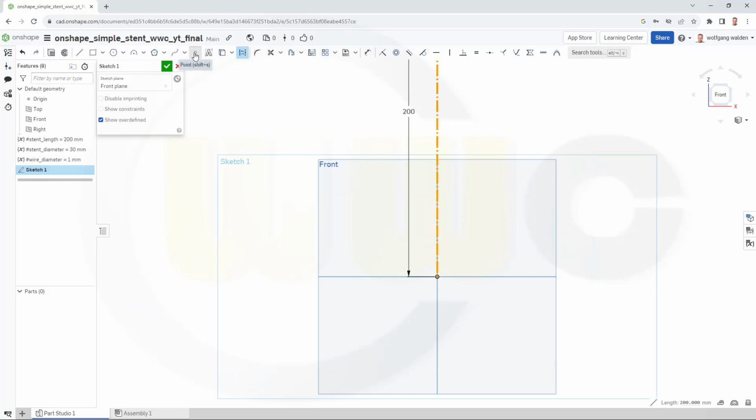Then I will need a point, and I put that point right there. And the distance here should be, I need it for my spline. So let's add a dimension. And this should be hashtag the stent diameter divided by 2. And okay.